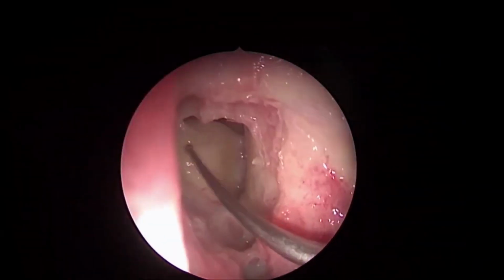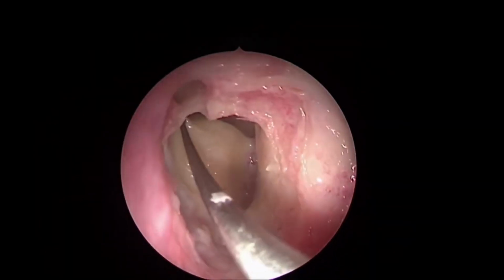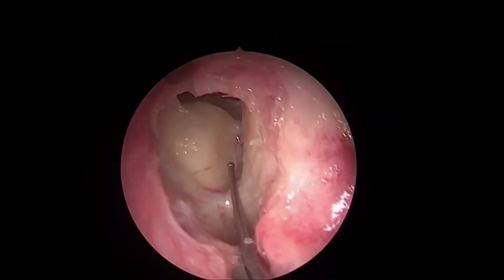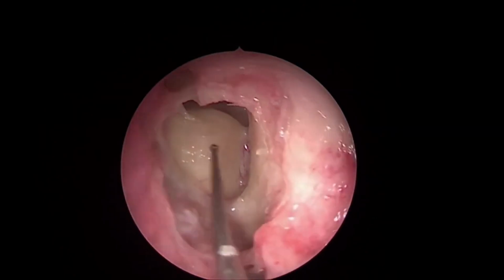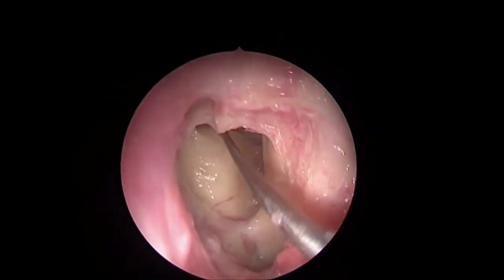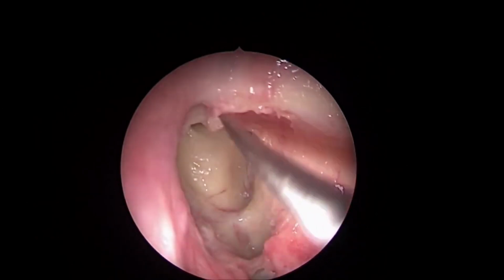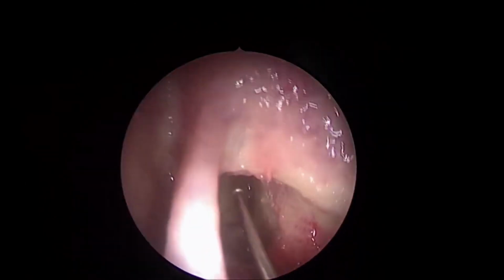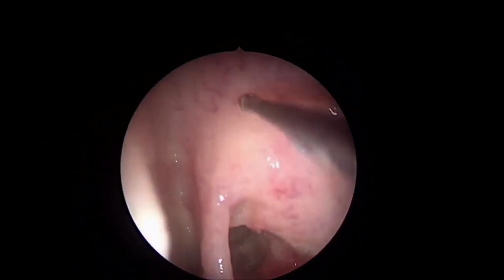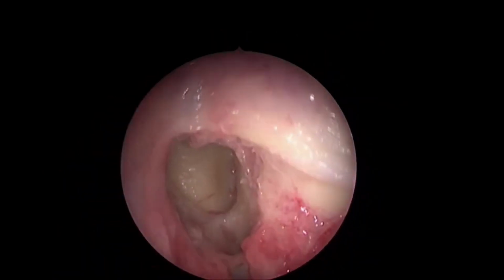So what I was saying, for the expanded indications of the frontal sinus that Draf had described, the only area which we can expand, or where the entry of the frontal sinus can be enlarged, is the anterior wall. See, there are no critical structures on the anterior wall. In the anterior wall, you can go right up to the external skin. There is no neurovascular structure to damage.